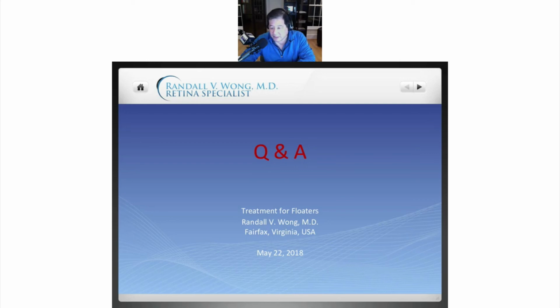Incidentally, and you can check this with everybody, I do not try to see the floaters that you see, because I should be able to see all of your vitreous and you should not be able to see any of your vitreous. So trying to find exactly what floaters you see that are bothering you is, to me, a moot point, because as long as you state that whatever you're seeing moves to and fro with eye movement, vitrectomy will be helpful.